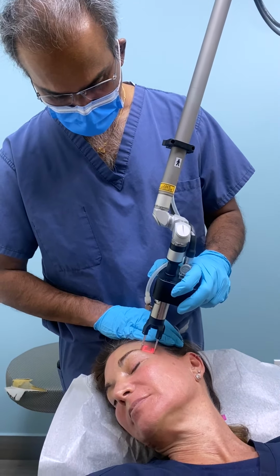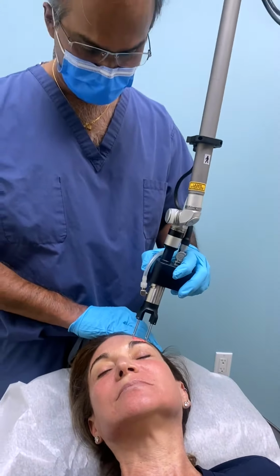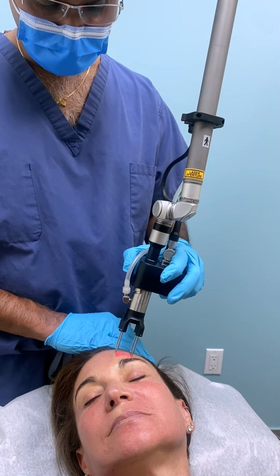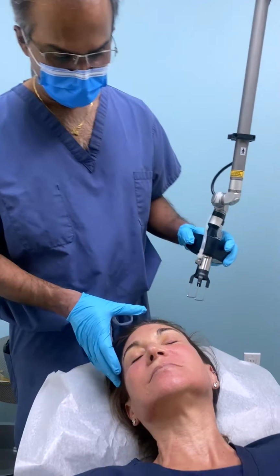And shrinks the pores? Yeah, the skin, as we all know, has a lot of different types of glands and structures. And this laser, since it's basically indiscriminately treating the surface layer of the skin, everything in its pathway has to regenerate essentially. And therefore, the same thing for the pores too, because the pores can also reform or regenerate, and they can shrink and function much better.